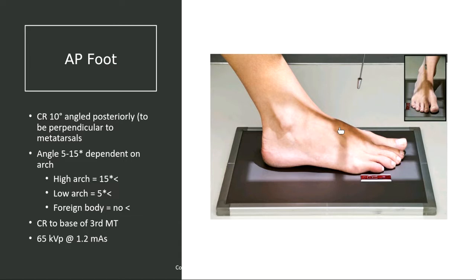Your technique is 65 kVp at 1.2 mAs. Again, technique is following the same as the hand so far. 65 at 1.2.